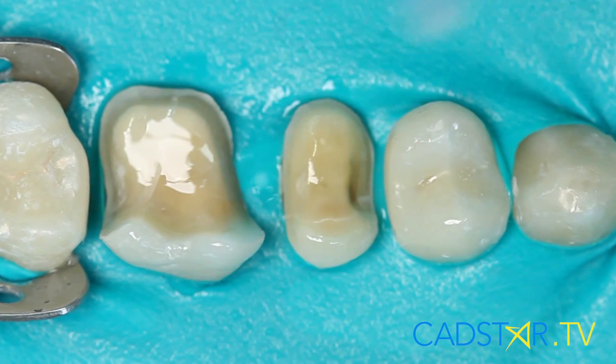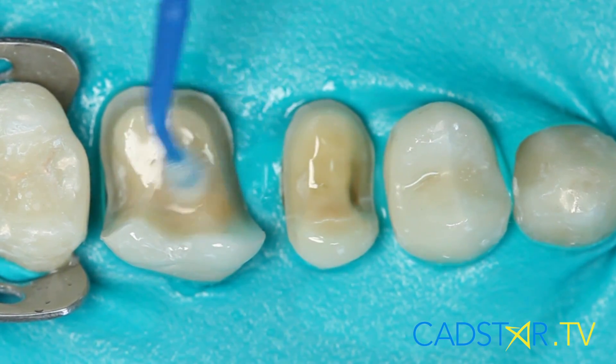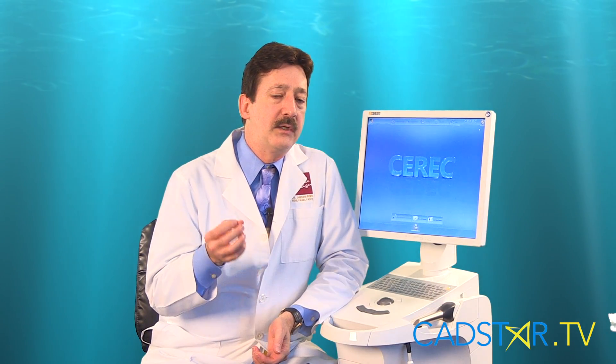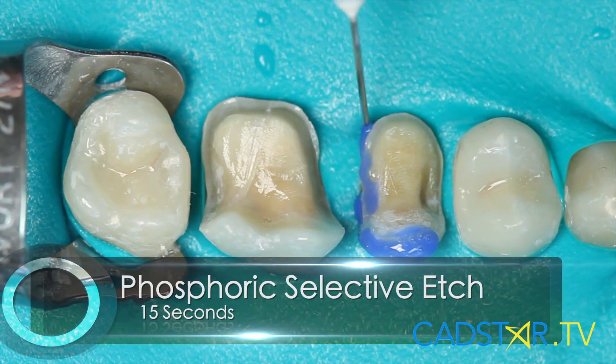Some people like to use Gluma or a similar conditioner to desensitize our dentin. That's great. There are a lot of great desensitizers on the market. Probably the best combination is to get one or two bonding systems down and then don't mess around with it too much. Each one is different. I'm still of the position where I like to optimize my enamel with selective phosphoric etch on the enamel.